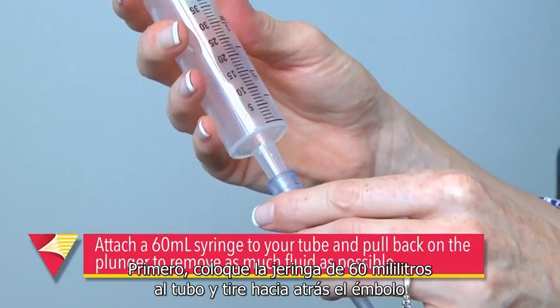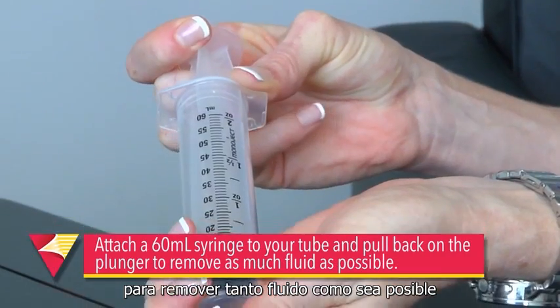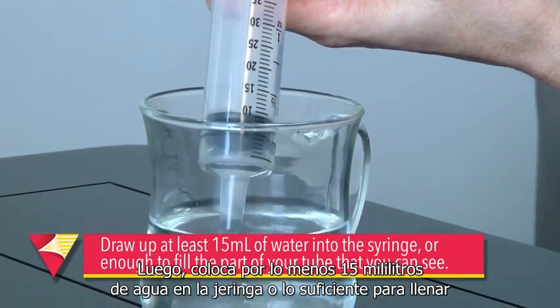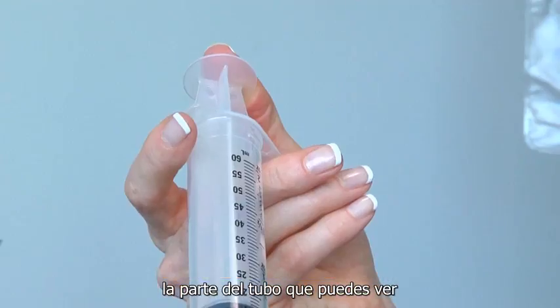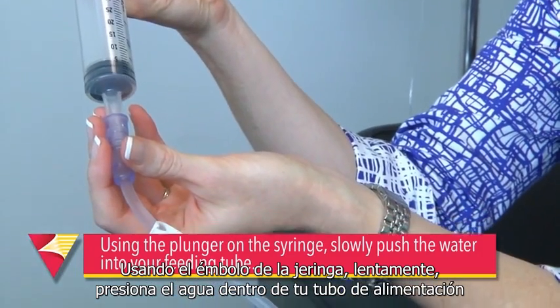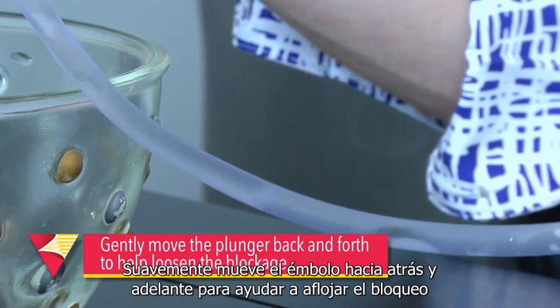First, attach a 60ml syringe to your tube and pull back on the plunger to remove as much fluid as possible. Then draw up at least 15ml of water into the syringe, or enough to fill the part of your tube that you can see. Using the plunger on the syringe, slowly push the water into your feeding tube.